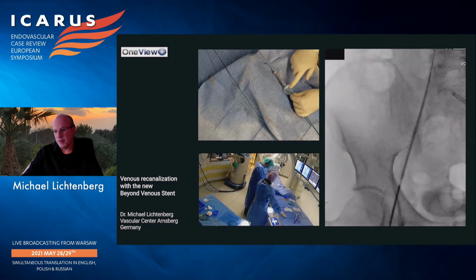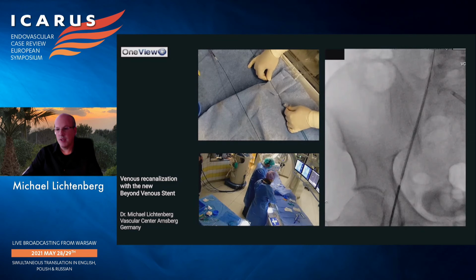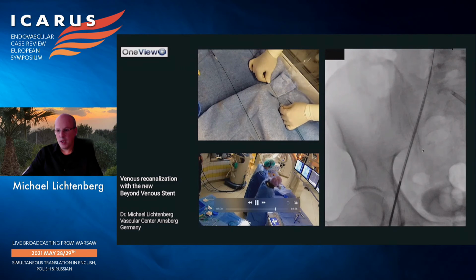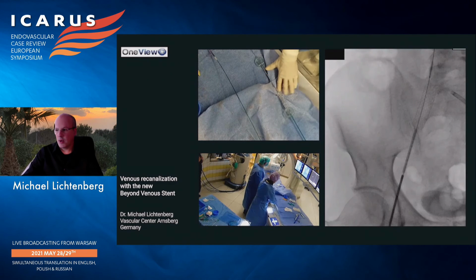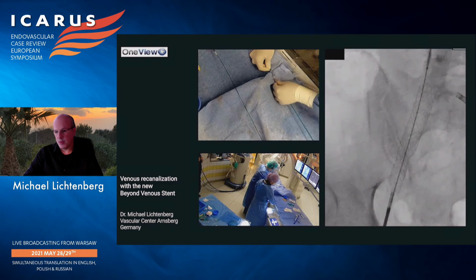And the good thing is you have also markers on this catheter. This is the new stent here, which we use now. It's a pin and pull technique, 10 French system, a laser cut dedicated venous stent from Bentley, as mentioned, called the Beyond stent. This is a 14/120 stent here. The pin and pull maneuver is shown here. The stent nicely opens, no foreshortening, no jumping, very precise implantation. Of course, like with all these pin and pull systems, very slow deployment of the stent is always recommended.